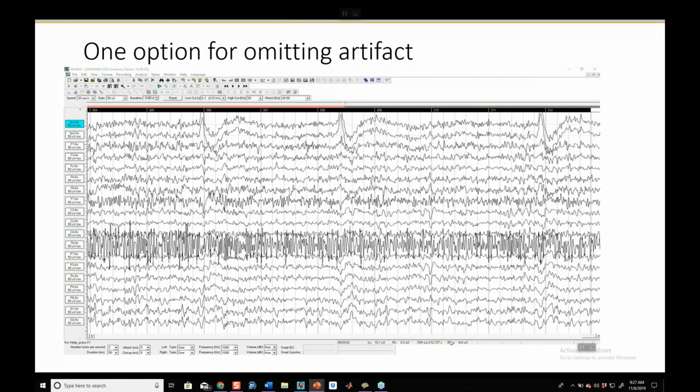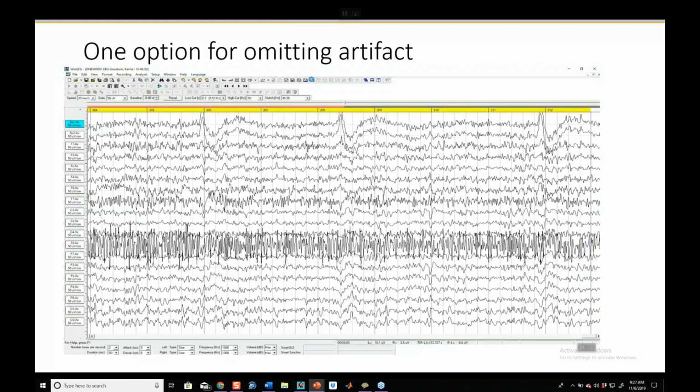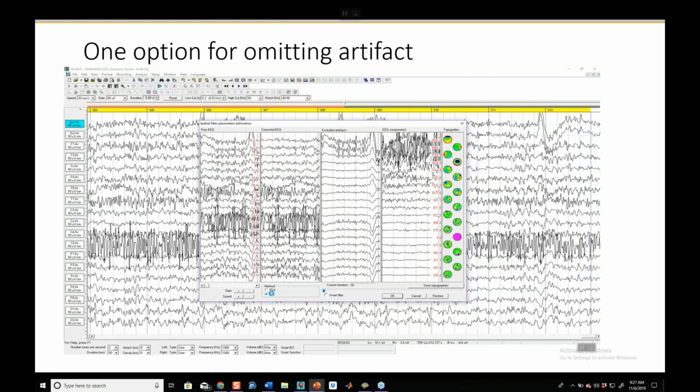However, there is another way to get around it, and it's, I guess, a more advanced form of computational neuroanalysis, but it's not that hard, and I believe it's the direction that our field is going. And so it's using independent component analysis cleaning. And to be real simple about this, I'm just going to remove what I'm seeing there at T4. In this case, it's called T8. I'm clicking on ICA, and what this program is going to do is it's going to isolate the different components in the data, and I'm going to look for T4, for that nasty loud bugger.